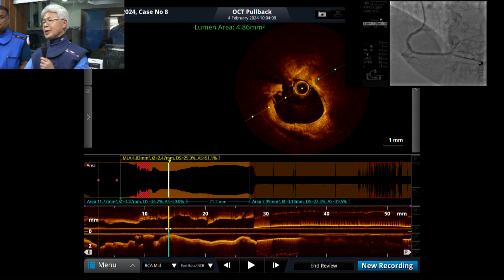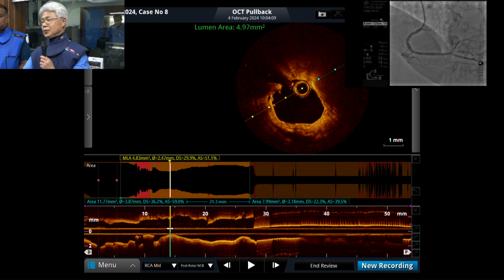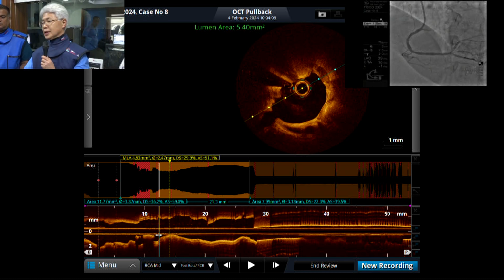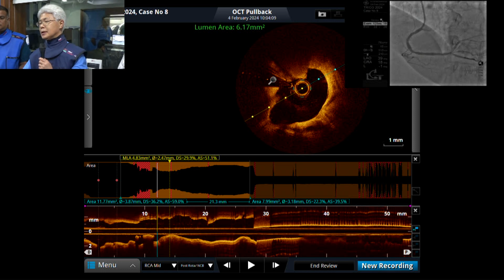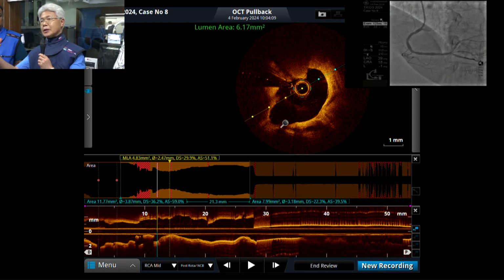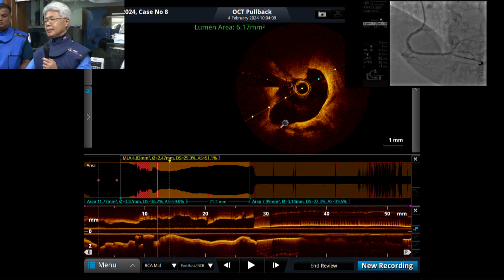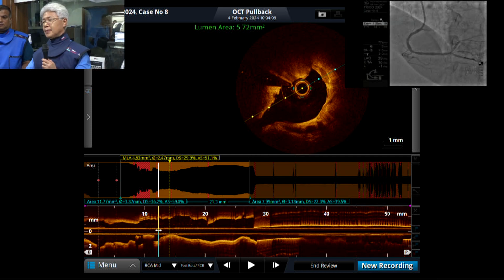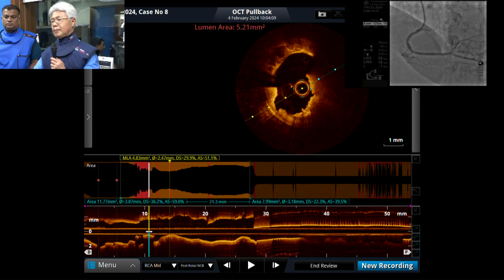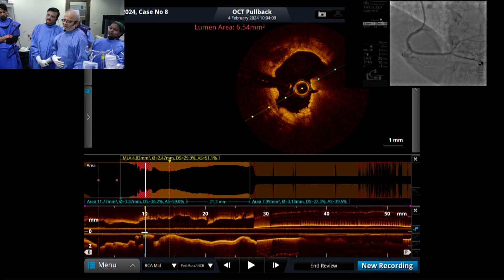But there is some discussion at the site of the nodular calcification back side. If there is a seat of calcium, if we have a crack, we can dilate much more, right? Yeah, that's what I feel. And if you don't mind, if we don't do IVL and we see after the OCT run, it will be a good demonstration and I am sure that nothing will go wrong.